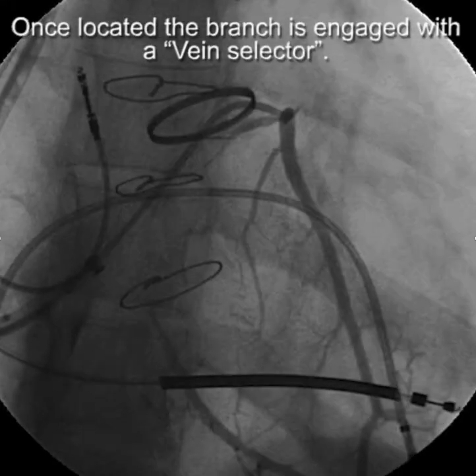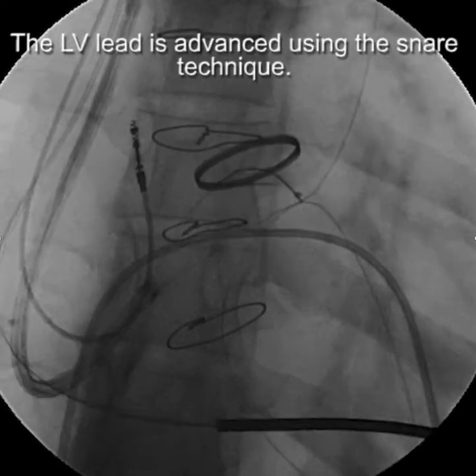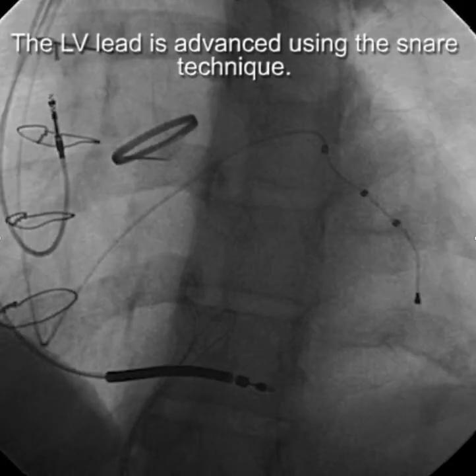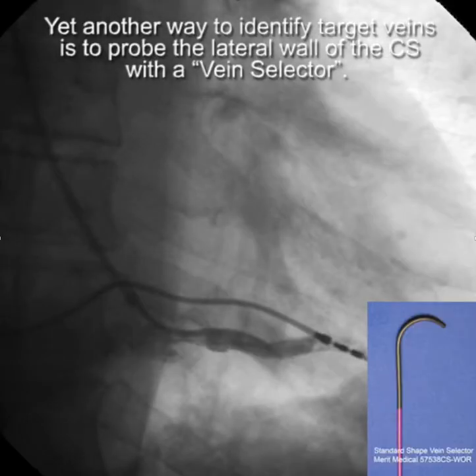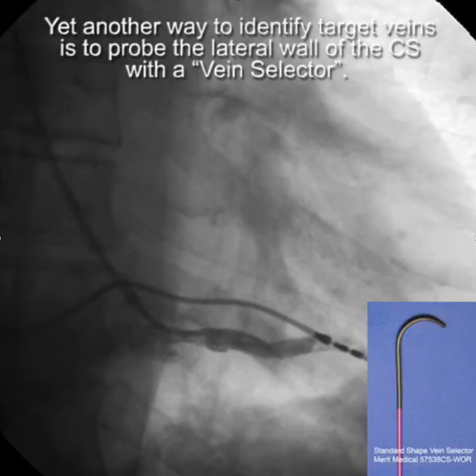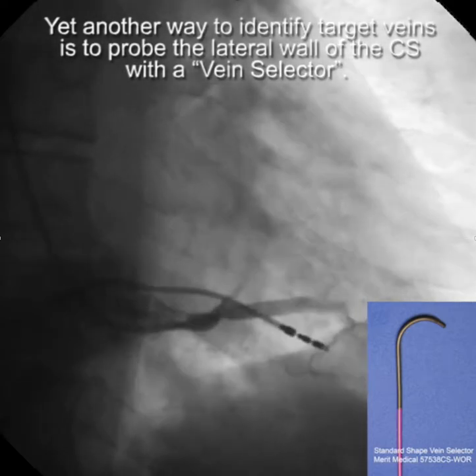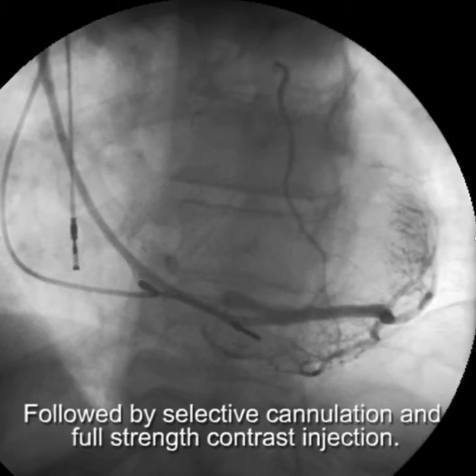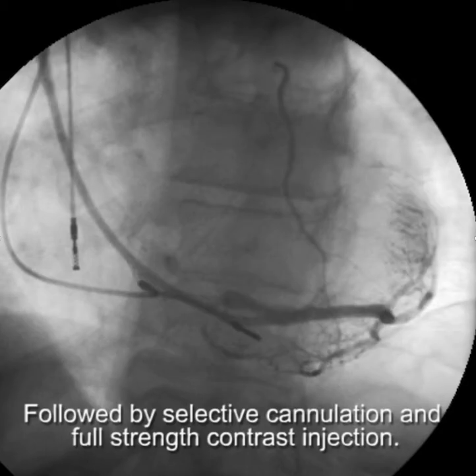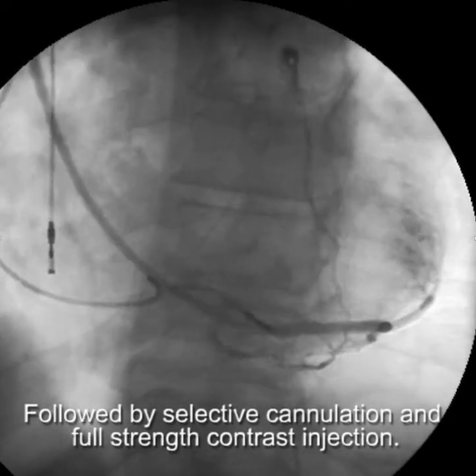Once located, the branch is engaged with the vein selector and then the lead is implanted using the SNARE technique. Yet another way to identify target veins is to probe the lateral wall of the CS with a vein selector, as illustrated here. Once you find the vein, selective cannulation and full-strength contrast injection will reveal other implant options.